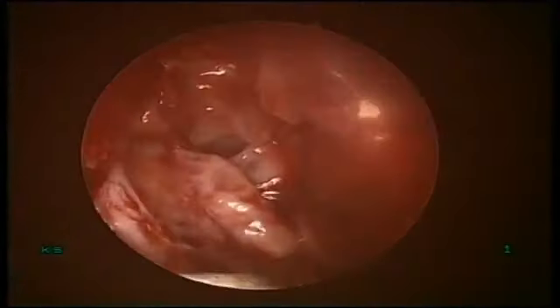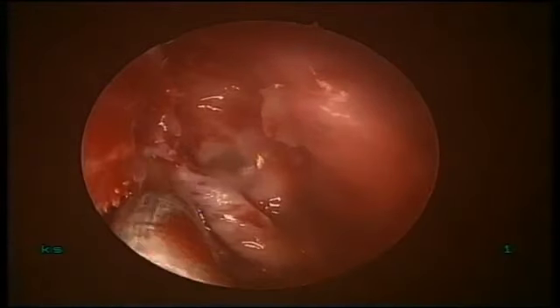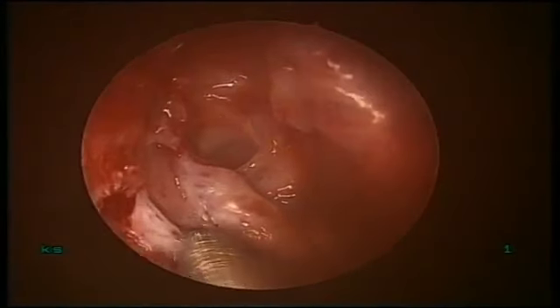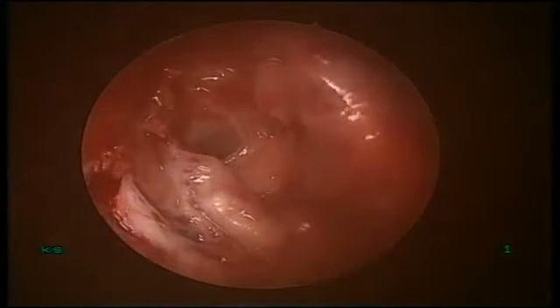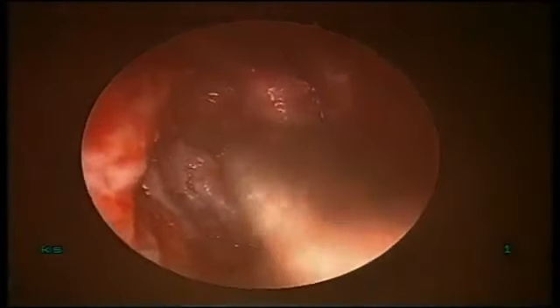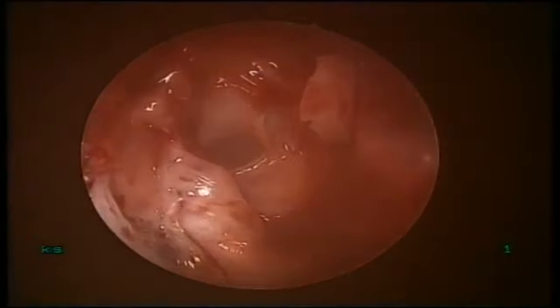See the secretions. All secretion there. See this purulent secretions. Can you see the sac completely? Yes, sir. See both flaps on both sides, lying without any tension. And if I stabilize these flaps, they were never going to come back.